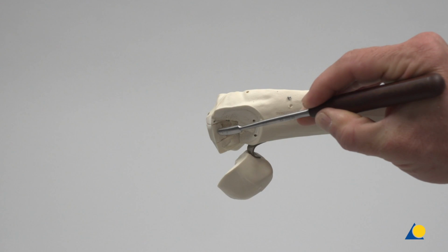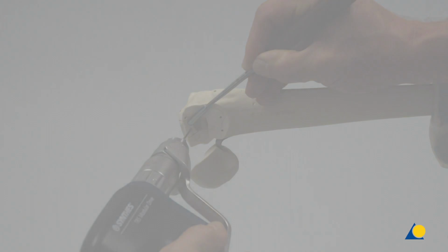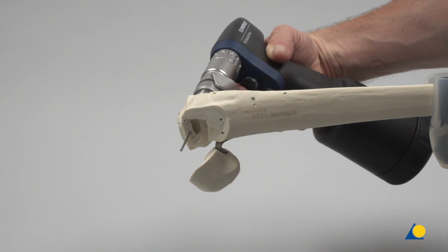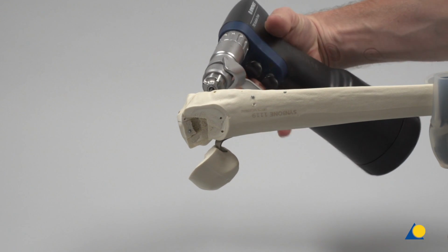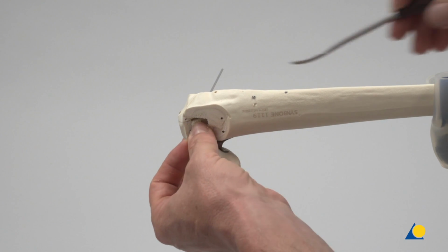The central impaction is elevated with a pusher and provisionally fixed with a K-wire. The K-wire is advanced through the medial cortex and is then pulled medially until it is flush against the inner wall of the impaction. This repositioning and fixation of the central impaction will facilitate later closure of the primary fracture. Bone graft is compressed into the cavity to support the central impaction.